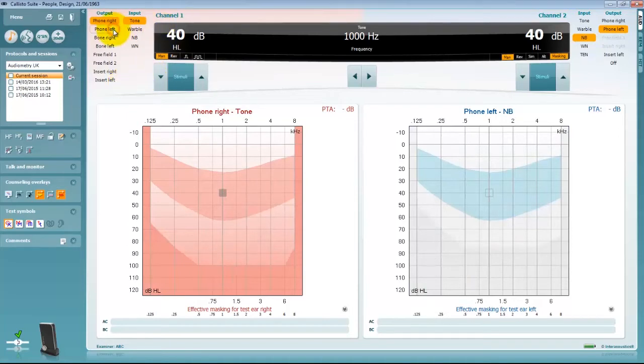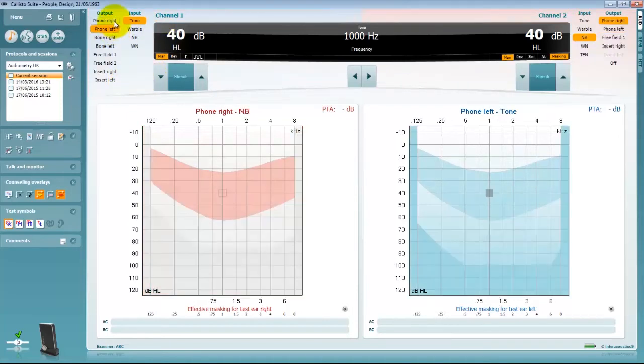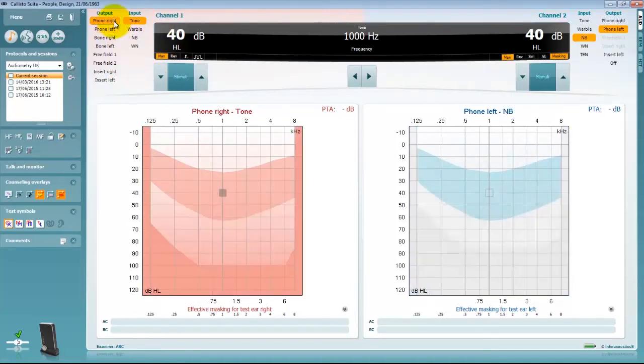Should you wish to change the test ear with your mouse you can choose to click on the ear side graph that you want to test or choose the opposite transducer in the channel 1 output list.